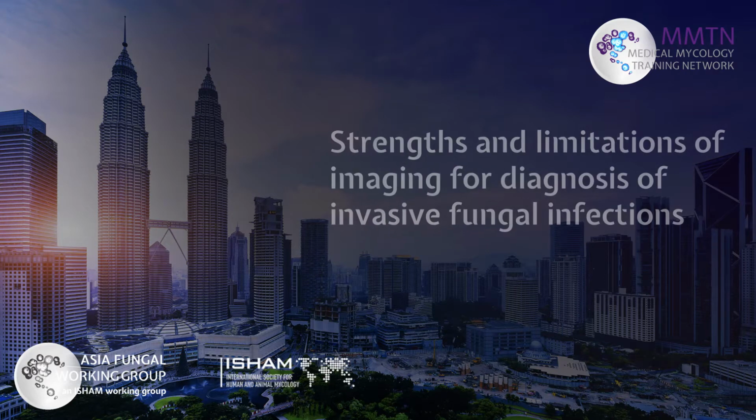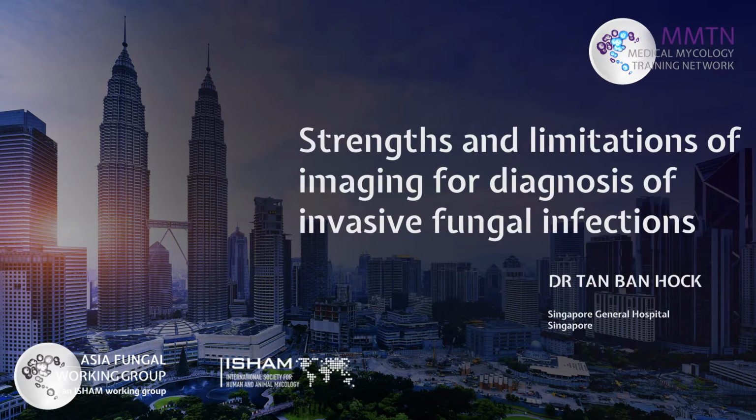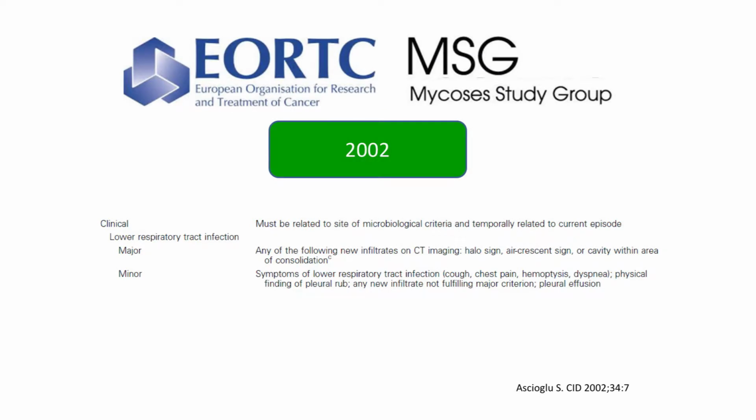So imaging is actually central to the diagnosis of invasive fungal infections. And in the first of its guidelines that they issued, the EORTC MSG group actually put imaging features as a major criterion. And as you know, the symptomatic features like chest pain and hemoptysis, those were only a minor criterion.